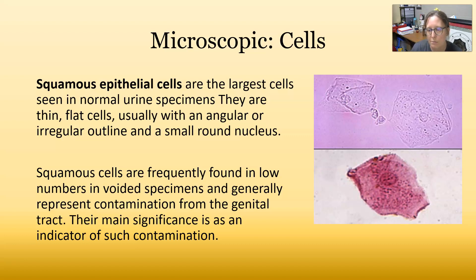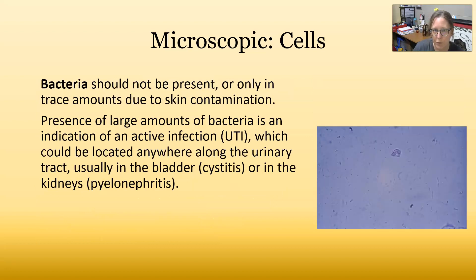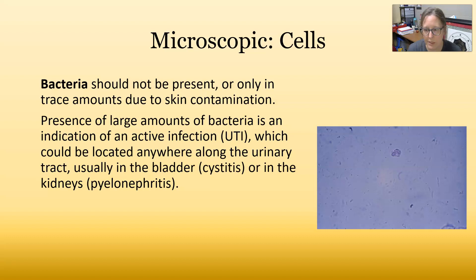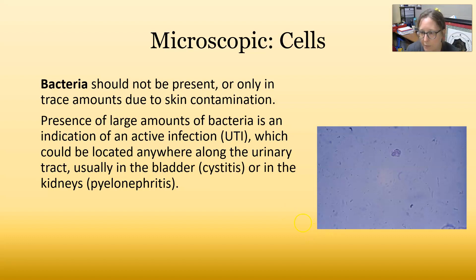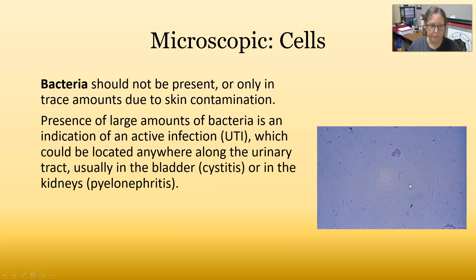Squamous cells are frequently found in low numbers in voided specimens and generally represent contamination from the genital tract. Lots of epithelial cells means a contaminated specimen. Bacteria should not be present, or only in trace amounts due to skin contamination. If you also see a lot of squamous epithelial cells with bacteria, that could just be contamination, but the presence of large amounts of bacteria is an indicator of an active urinary tract infection, located either in the bladder (cystitis) or in the kidneys (pyelonephritis).